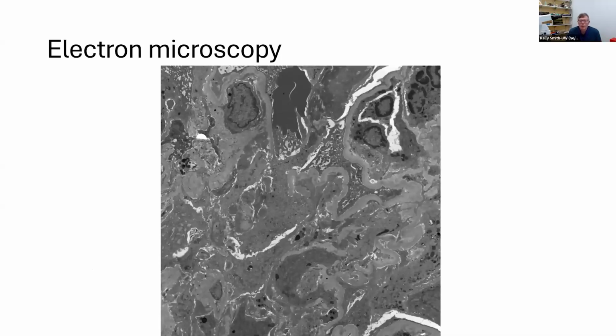I inserted the electron microscopy around this time; the EM also came back. Yeah. So the EM was like every other specimen in this patient. All the glomeruli were involved by crescents, and so you can see what a mess this is.